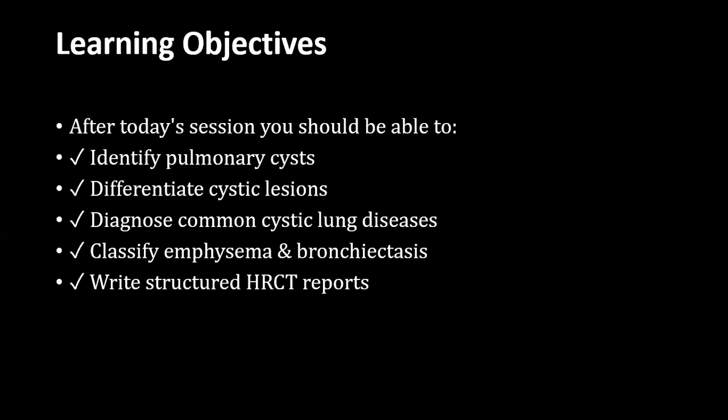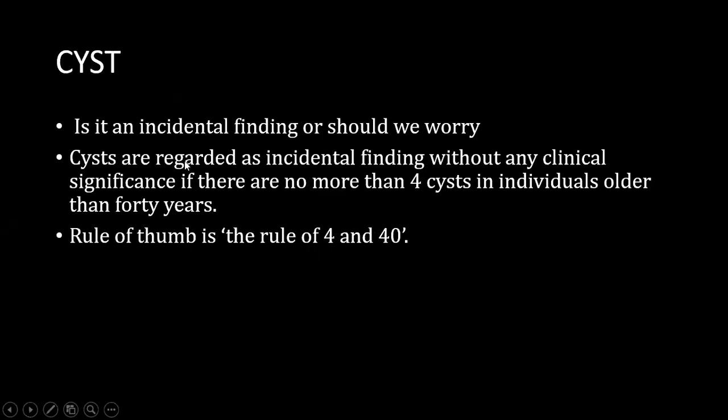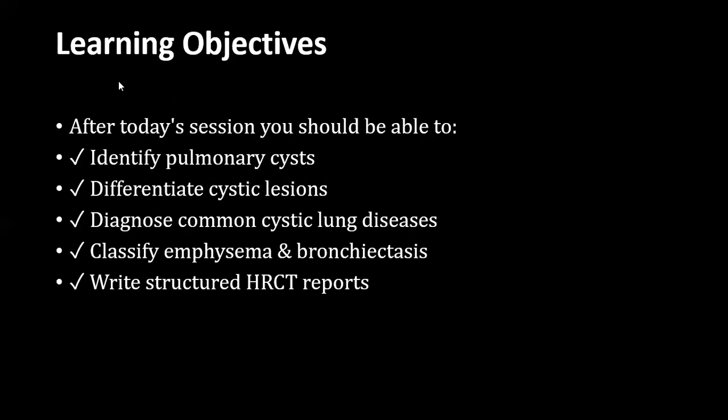I'll end this course by today's session, and we will be discussing pulmonary cysts, differentiating different types of cystic lesions, and then we will diagnose and discuss the most common cystic lung diseases. We will learn how to classify emphysema and bronchiectasis, and then we will learn how to write a structured HRCT report. So without further ado, let's get started.